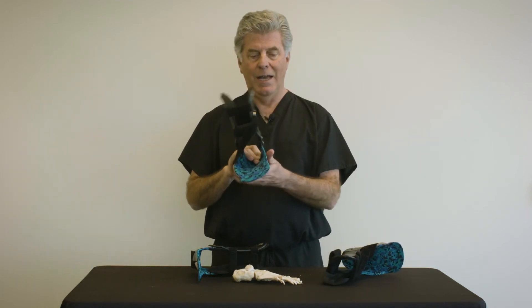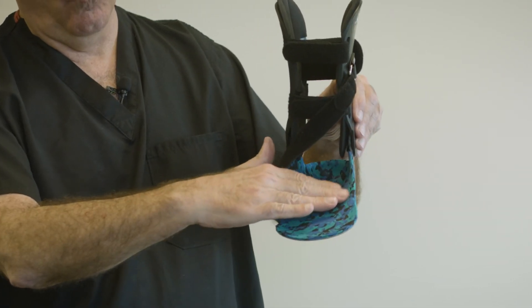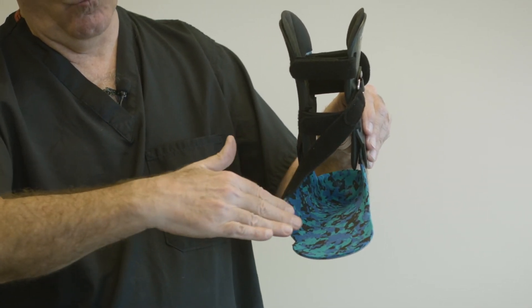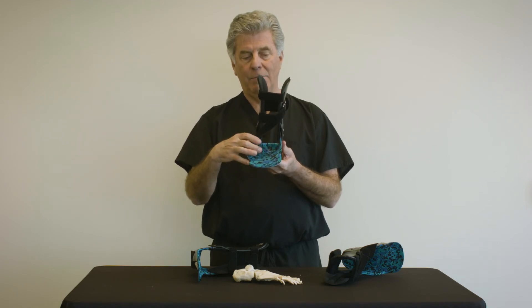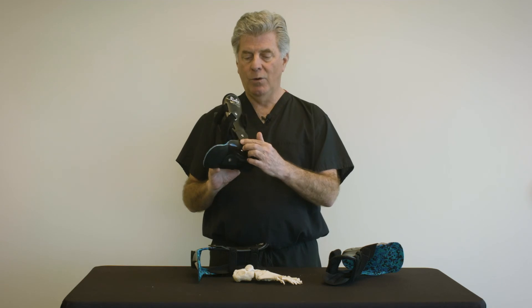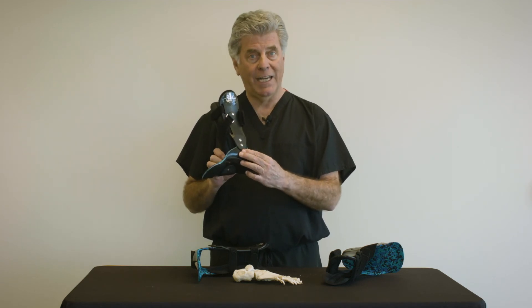Conversely, a medial flange tends to set up a ramp medially that the foot can slide laterally on. That lateral slippage can be eliminated by grinding away the medial arch or avoiding the medial flange altogether.